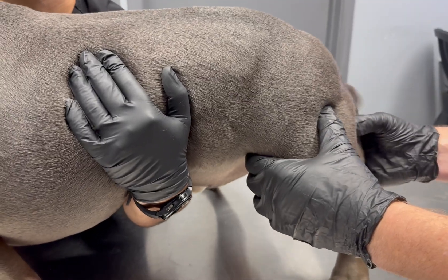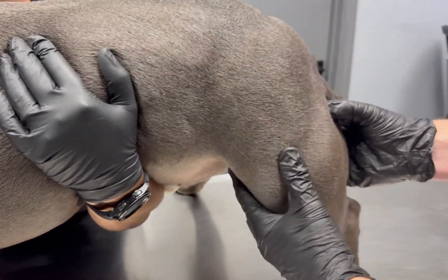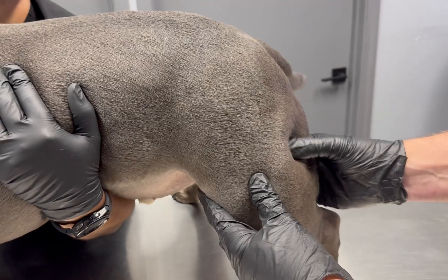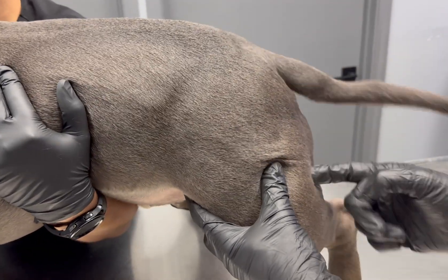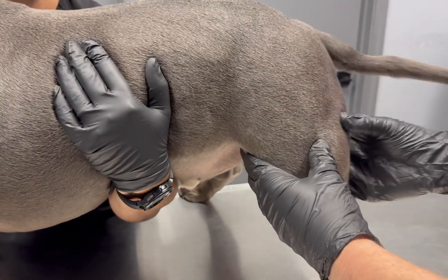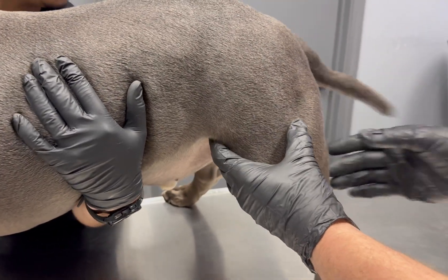Sometimes the third spot is back here on the hind side of the leg. I typically try to avoid this for the most part, just because that sciatic nerve runs down and branches down here. Although it's low concern, it is a concern there.